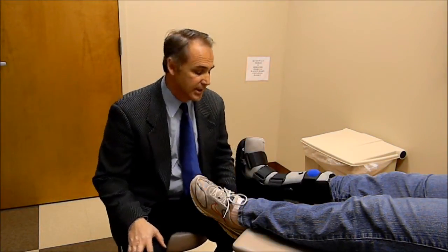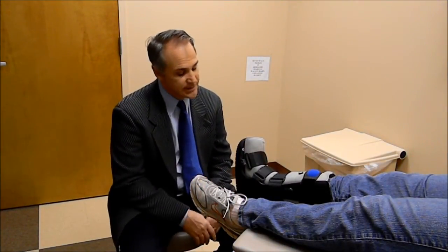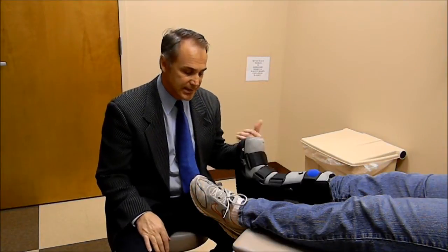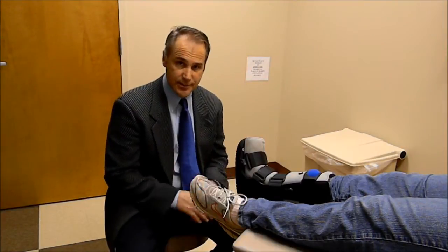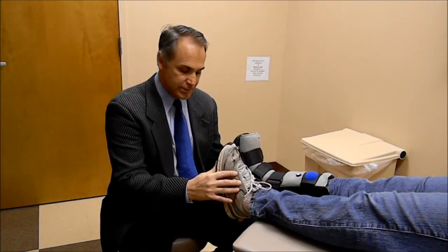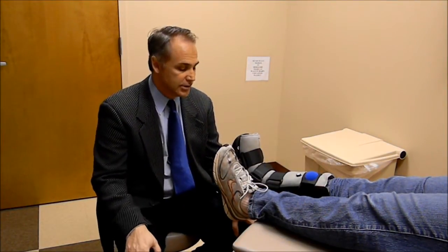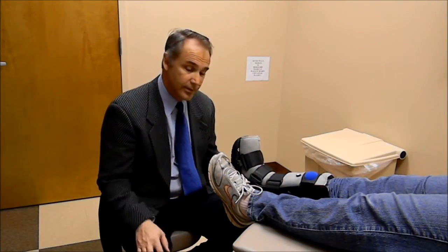The problem with fracture boots has been that in order to allow a patient to walk more normally in these, we have to have a fairly thick sole that is rocker bottom to allow a normal range of motion at the knee and hip. Unfortunately, that thick sole creates a limb length discrepancy. That limb length discrepancy — you can easily see if we line up the feet here — the sole of the shoe is about an inch deeper than on the other side, even in an athletic-type shoe. And that creates a limb length discrepancy that causes hip, knee, and back pain for a lot of patients.